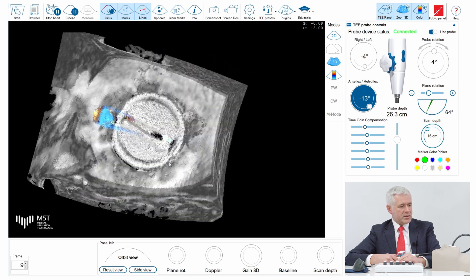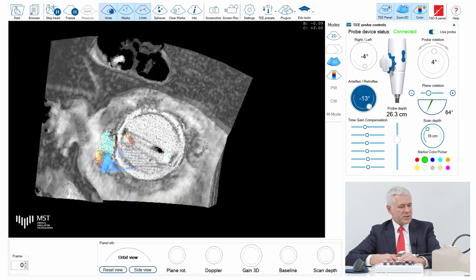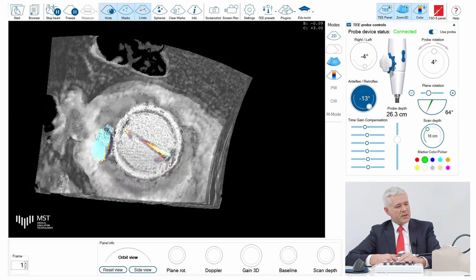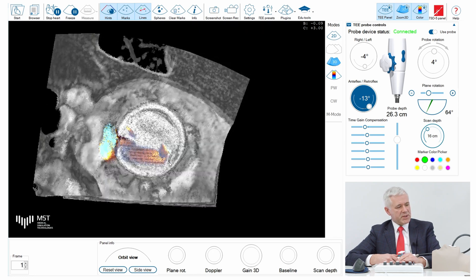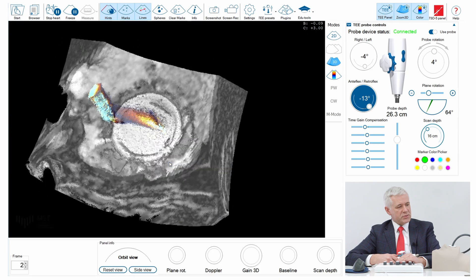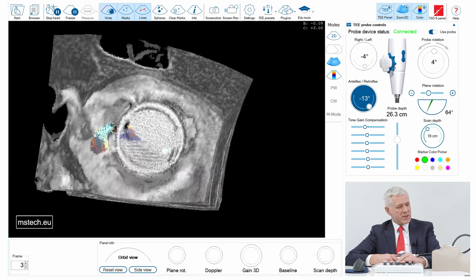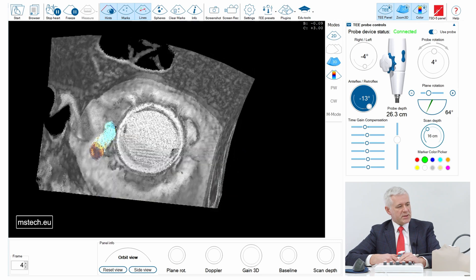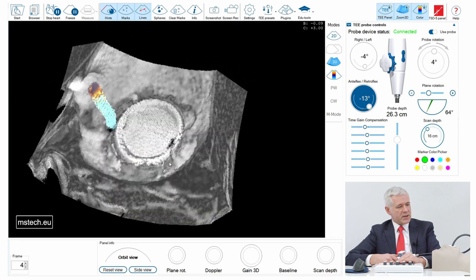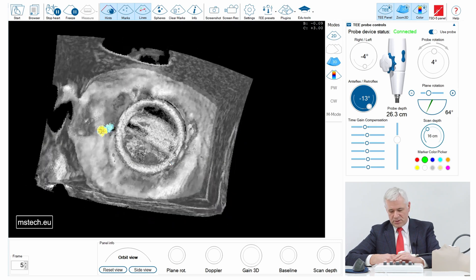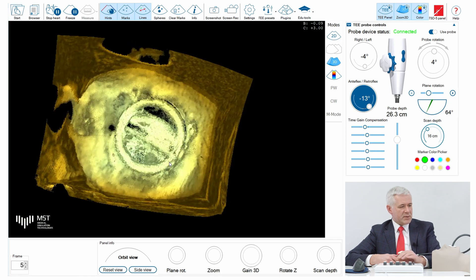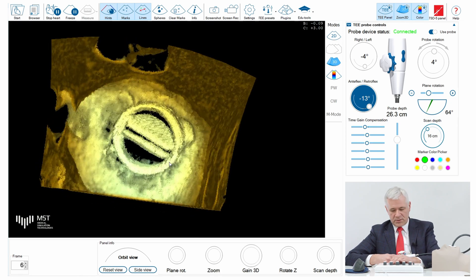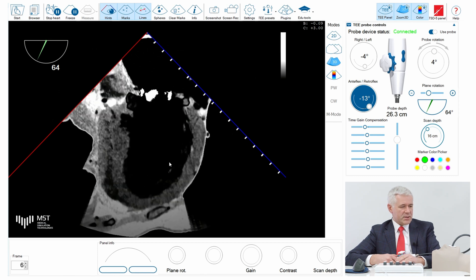This is a typical location where the leak can occur because the surgeon is afraid of suturing deeply into the tissues, as there is a circumflex artery behind the left atrial appendage that can be inadvertently sutured during surgery. So sometimes those sutures may tear out and create a little leak.